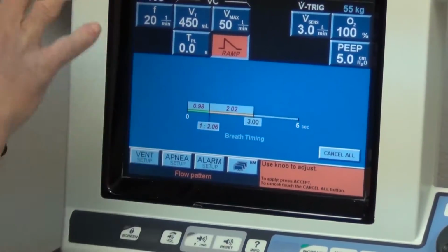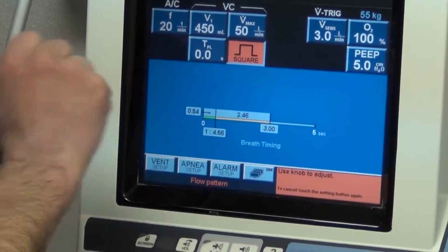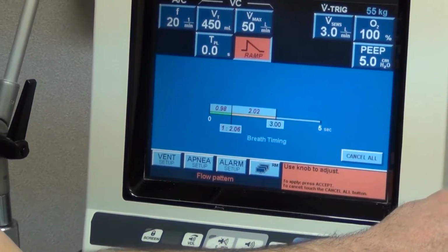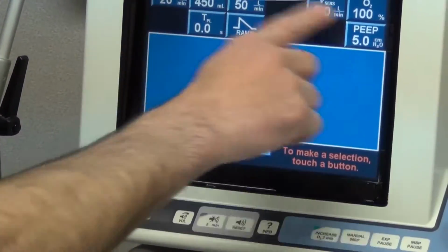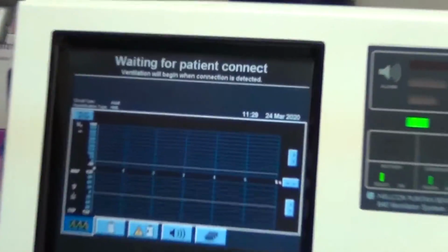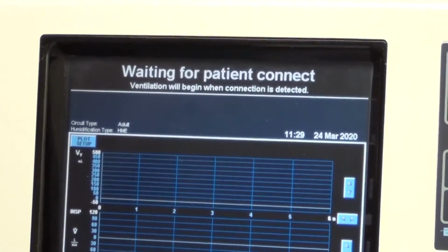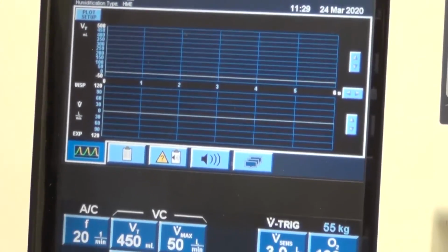So if you look at it and you see it shows square, you want it in ramp. It just makes it more comfortable for the patient. So you just turn it till it gets ramp, and then you hit accept, and it accepted it. Notice at the top now it says waiting for patient connect. You could technically ventilate the patient now, but we have not set our safety backups yet. So we want to make sure we do that before we connect the patient.